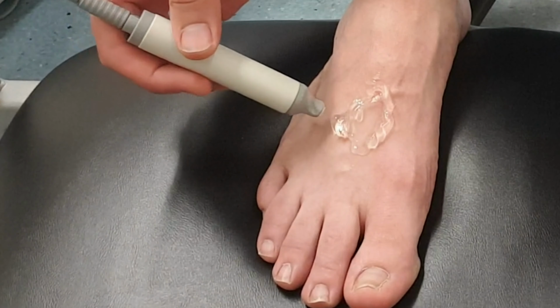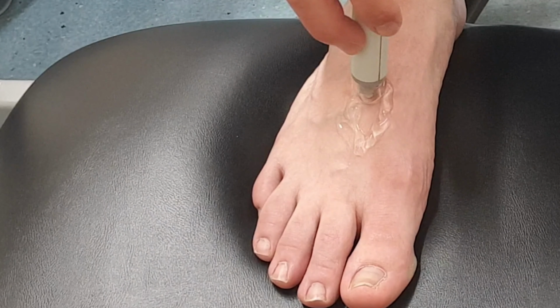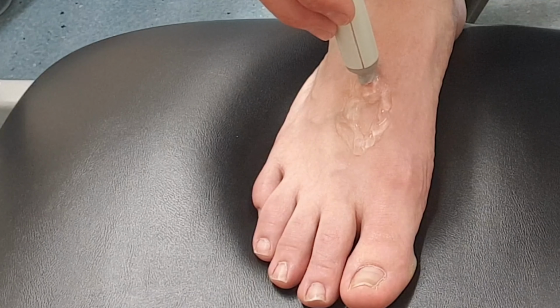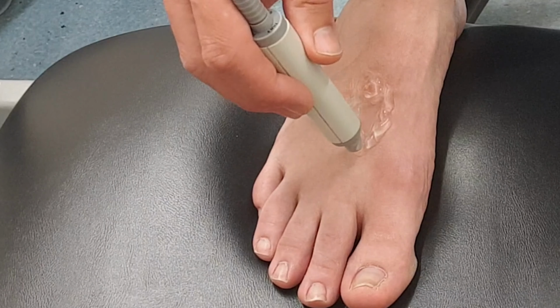So for the dorsalis pedis, you'll find it around about there. You'll find it between the first and second mets, right up at the top. The easiest way I find to do that is you can easily find the gap between the first and second mets. It's where the first and second toe gap is. So you start off about there, and then you just draw the probe backwards until you land on it.